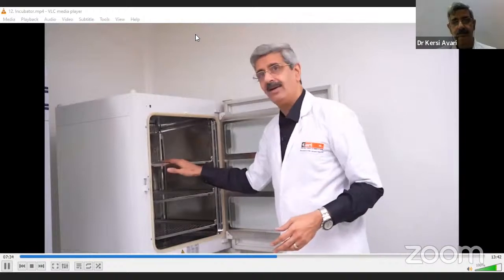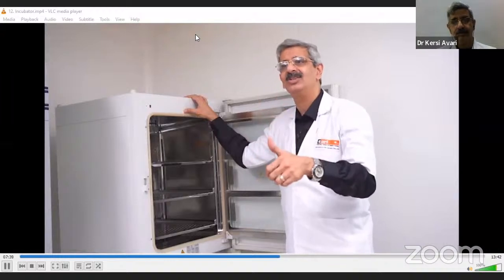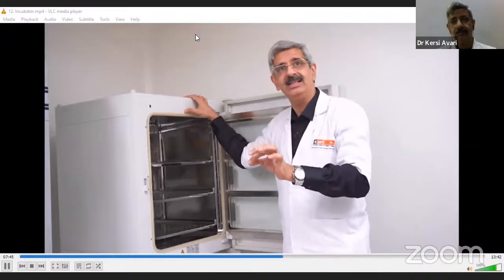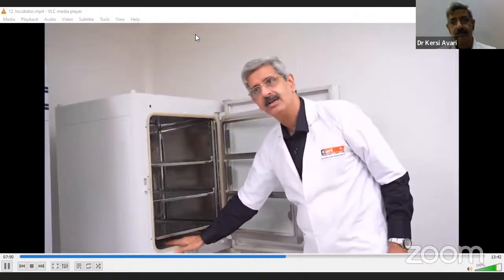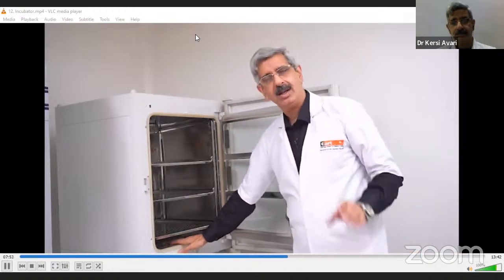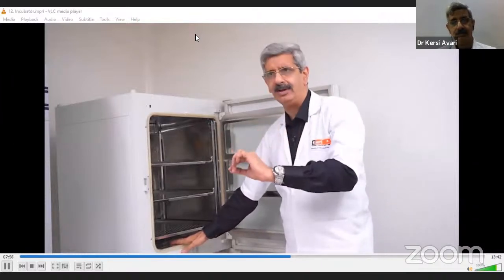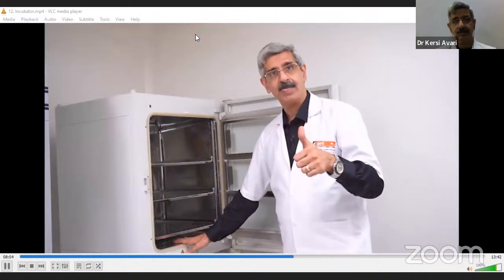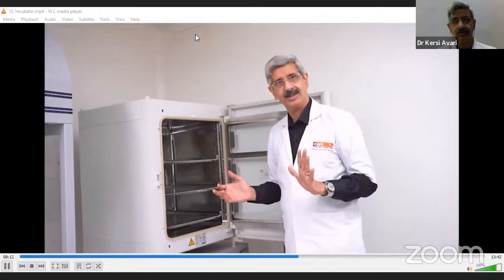People ask, is the first shelf temperature high or is the third shelf temperature high? Temperature everywhere in a box incubator is the same. A minor difference of just 0.1 or 0.15 degrees will be observed upper or lower. The lowermost chamber is a water tray in which, depending upon your product specification, 750 ml to 1 liter to 1.5 liter of pure distilled water is poured in. This is to ensure humidity. So the working ambience is humidified carbon dioxide at 37 degrees.